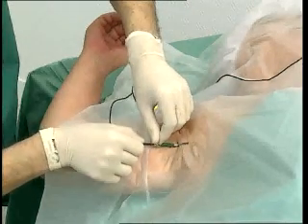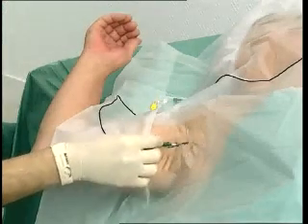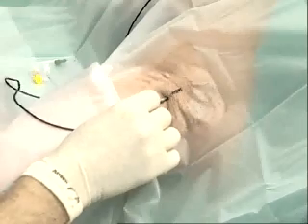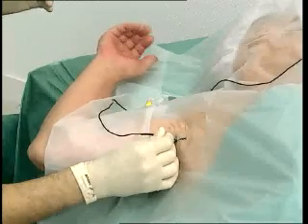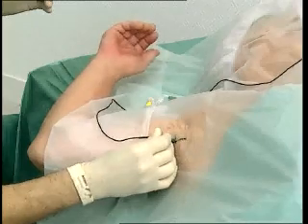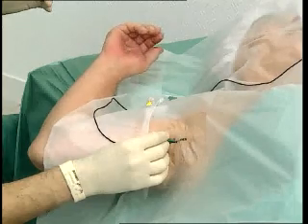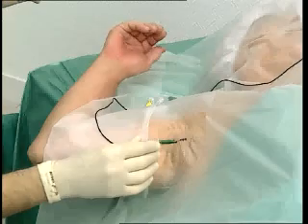Confirm the correct cannula position with the nerve stimulator. Move the needle in the sheath until an elicited motor response is observed — in this case, extension of the wrist and fingers caused by stimulation of the radial nerve, or ulnar flexion of the wrist and flexion of the fourth and fifth fingers due to ulnar nerve stimulation.